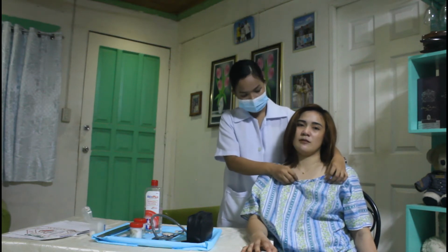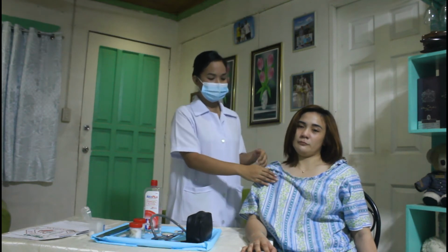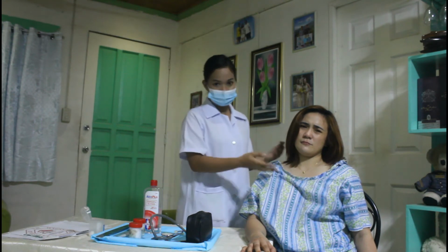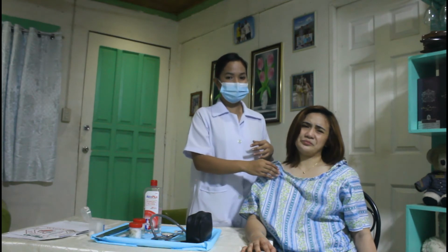Okay. Then, we move aside the gown to expose the sternum and the left side of the chest. So, this will provide better access to the anatomical landmark of our patient. So, then we locate the anatomical landmark of our patient to identify point of maximal impulse. So, to allow correct placement of our stethoscope.